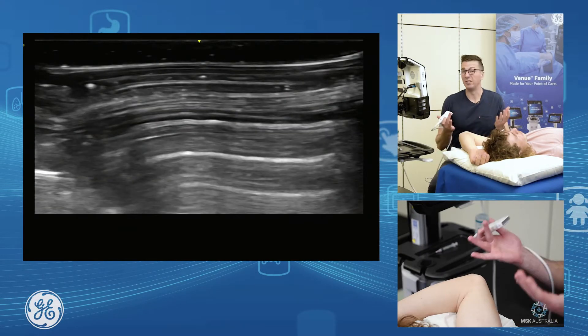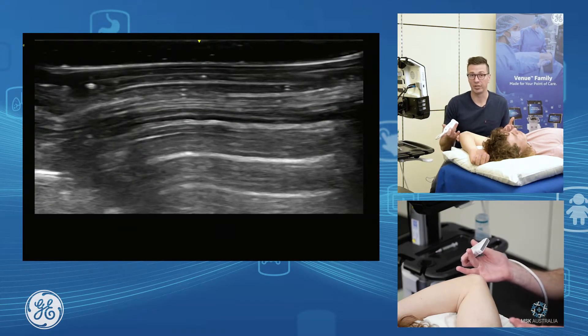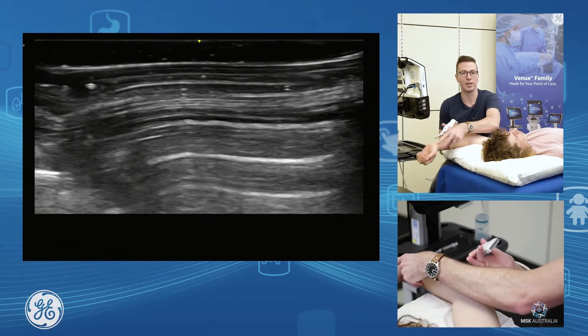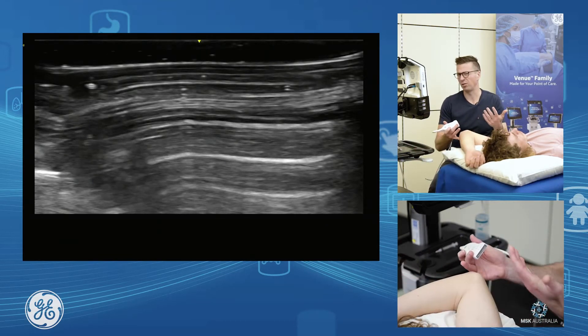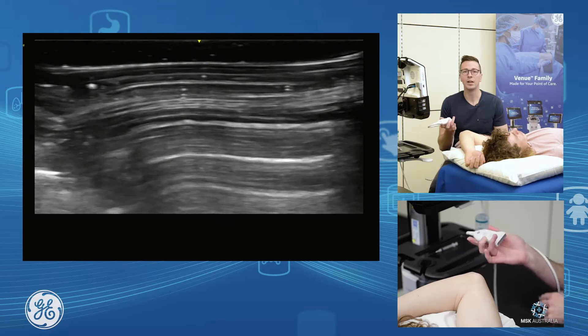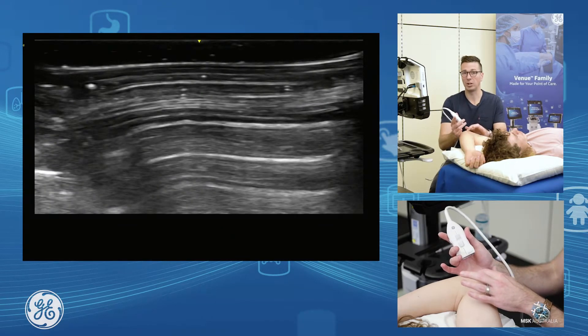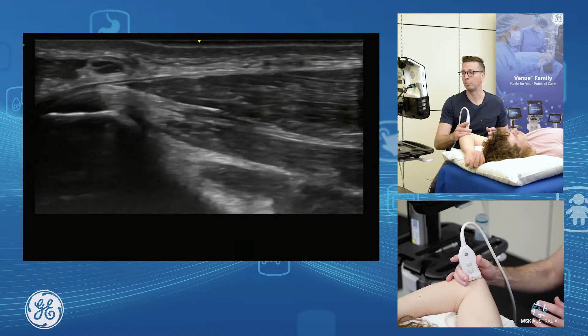Assessing the medial elbow, this is the position I like to use because it gives me good access to what I want to see. I can extend and flex the elbow, and it's really nice for interventional work as well. So if we look at the common flexor tendon, I pretty much just palpate the medial epicondyle and pop my probe bang down on top.